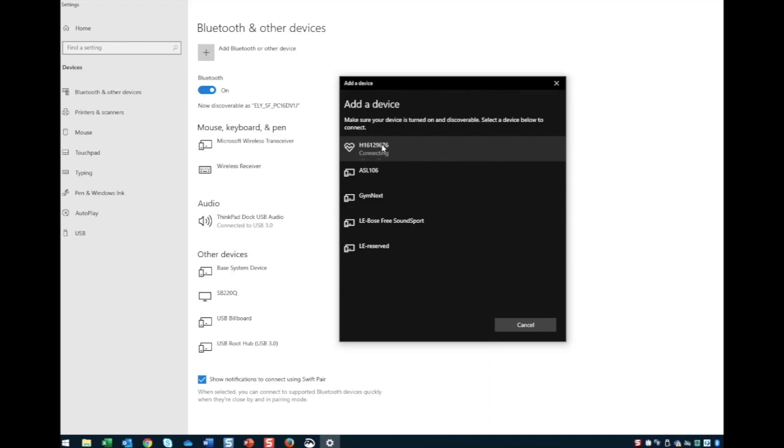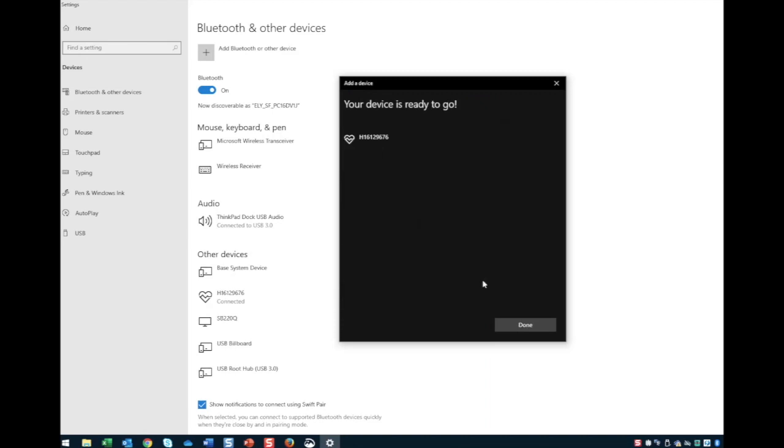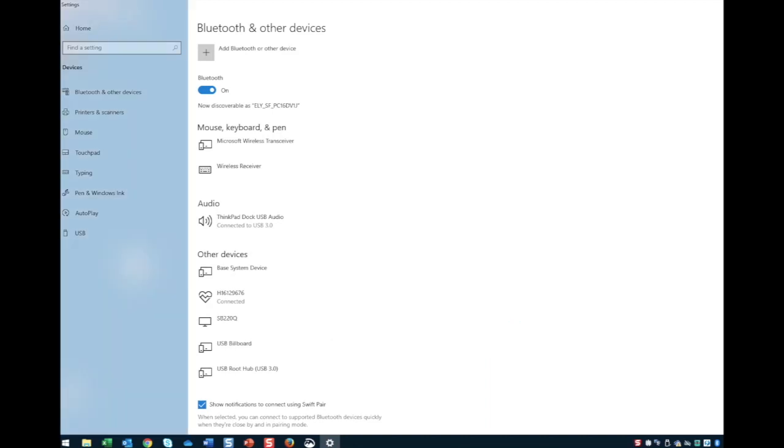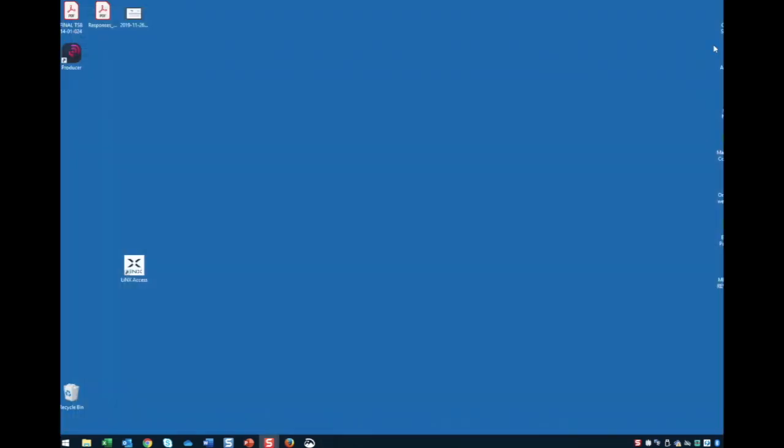After the LAC has paired to your device, we are ready to open up the software. Now, we will click on the Lynx Access software.